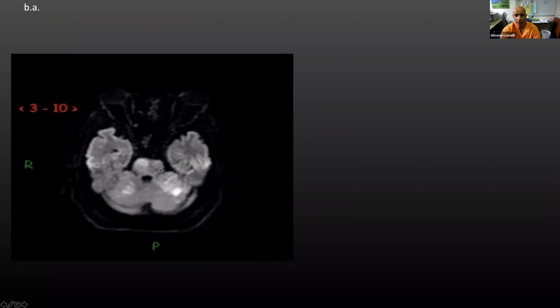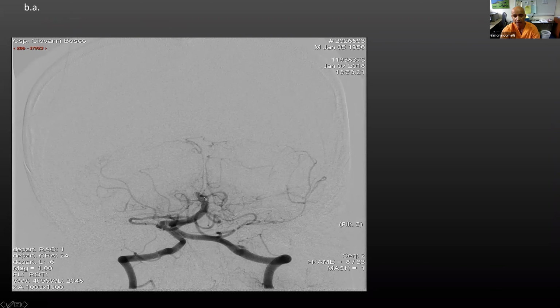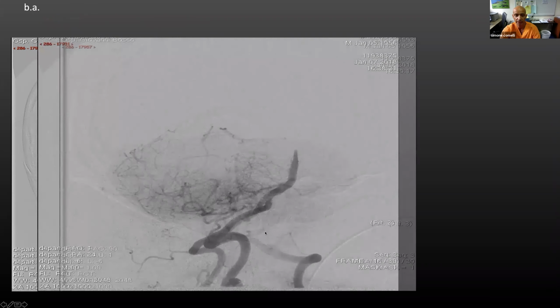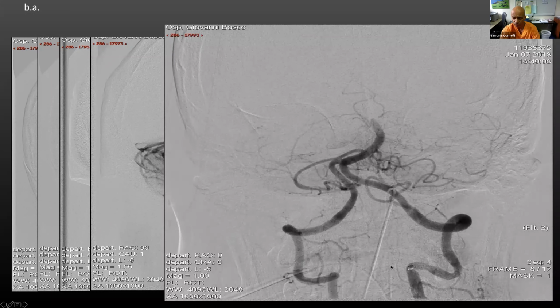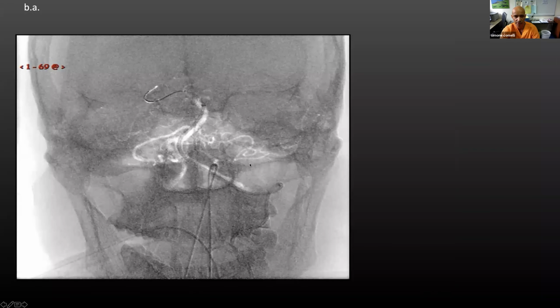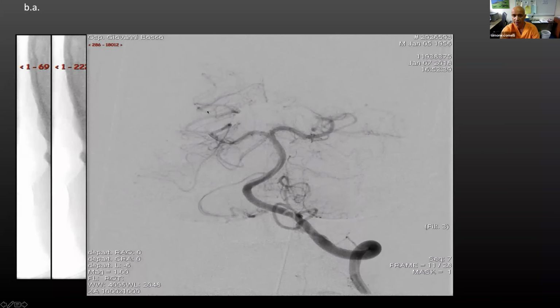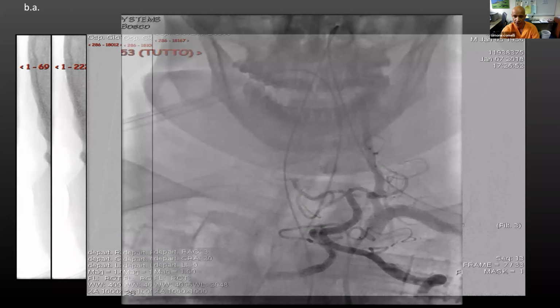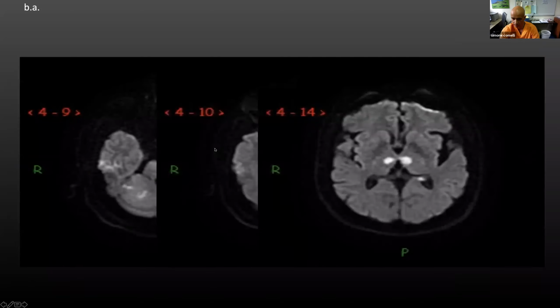Here we have another case of a posterior circulation. As you can see here, we have already some lesion in this part, cerebellar and mesencephalic. We decided to go. We ended up in the distal part of the vertebral artery. Our access was from the left side. We arrived very high. We have our NeuroMax, and then with just one pass at the tip of the basilar artery, we obtain a very good result without any kind of problem, as you can see here. The lesions are always the lesions we had before, so the result was not so bad.